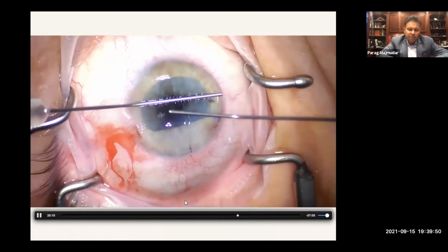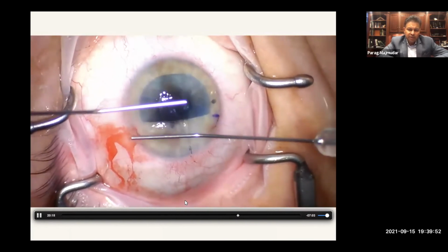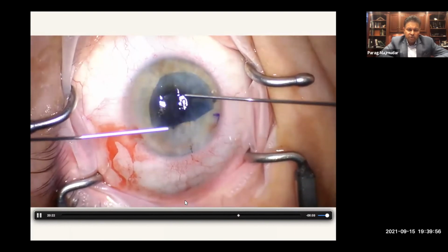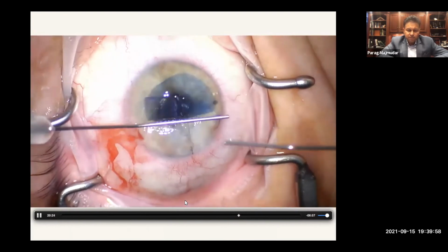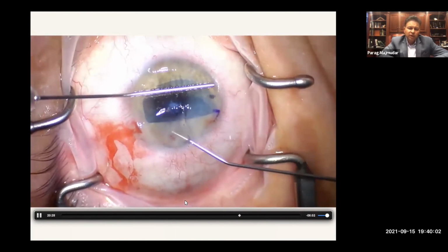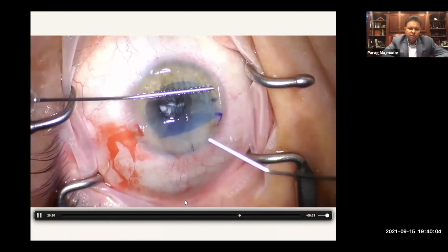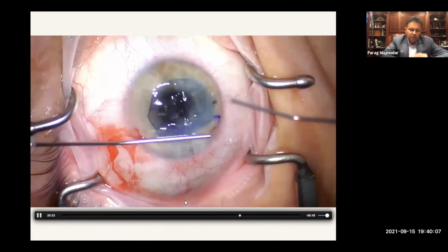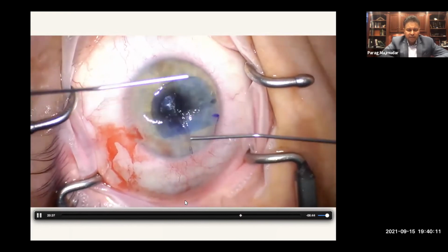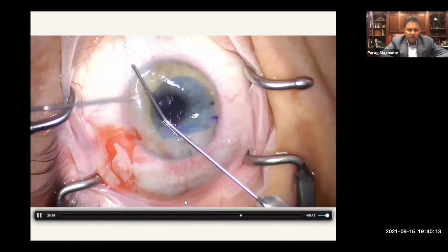And then I'm just tapping on the eye, tapping. This one doesn't want to go very smoothly, but it'll get there. Just be patient and it'll work. I like this 2 cannula technique because it really kind of holds the graft in position, and you can use it to sometimes just really stretch that out there and really flatten it out. And here you can see we're making progress, and all these maneuvers are on the corneal surface.